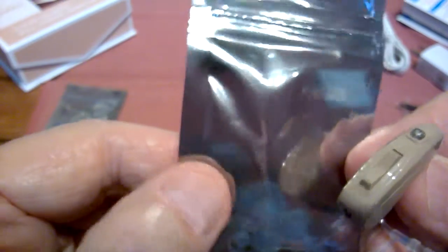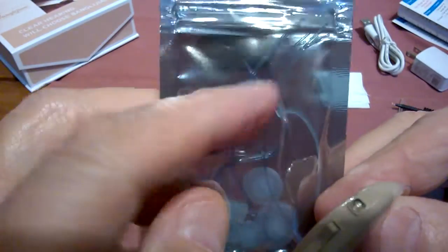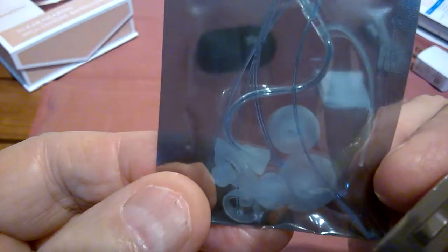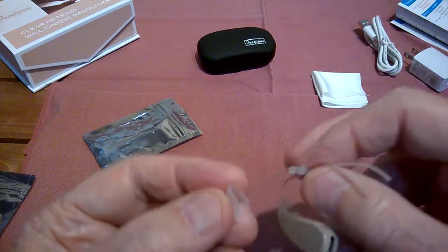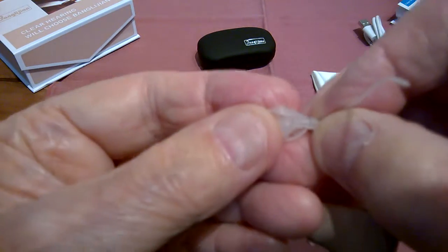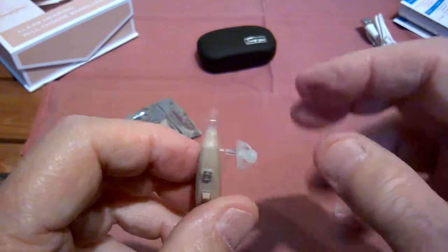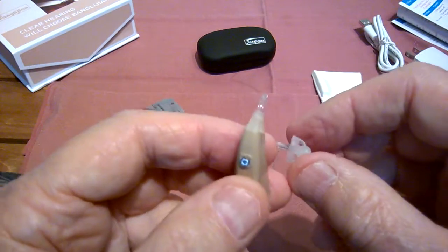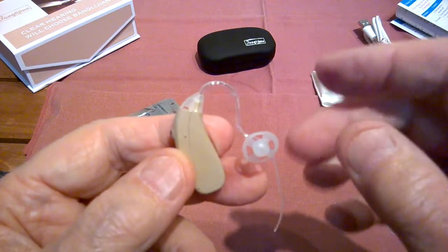And then these come with a variety of different ear tips that are dome-shaped. This is the right one. Each one comes with a selection of different ear tips. These that I like, having tried them, is this open design. And they go on, there's a little hole right there, and then this just fits in there. It's not complicated, nothing to thread. You just make sure it fits in there, and you're all done. Now, this will go behind your ear, of course, and this will go in your left ear. And these aren't adjustable. This is the way they're made to be, so don't even think about cutting them.